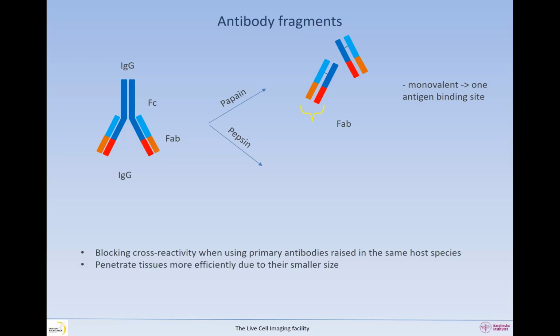And the good thing about them is that, because they are much smaller, they penetrate tissue more efficiently. But they will give rise to a lower signal if a fluorophore is attached to them, because there are fewer fluorophores or enzymes that can be conjugated to them.